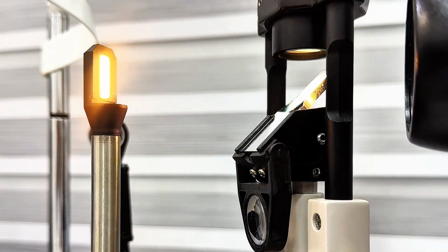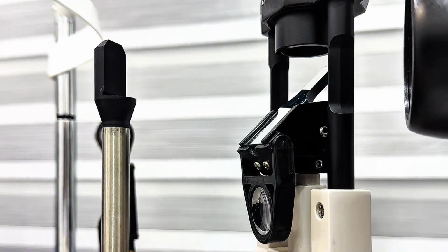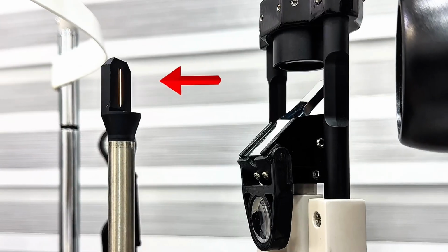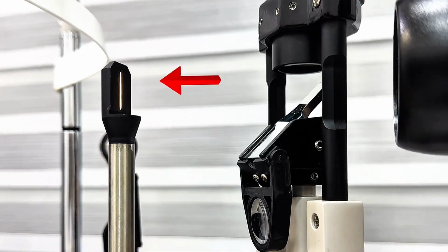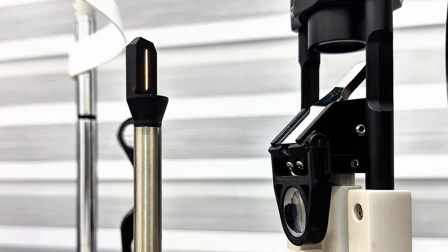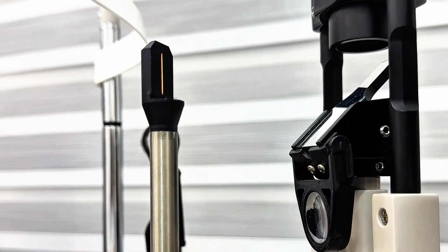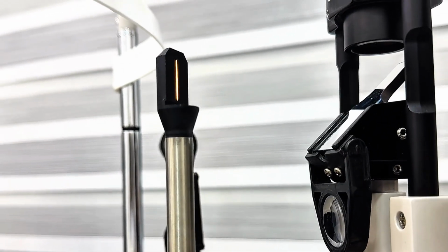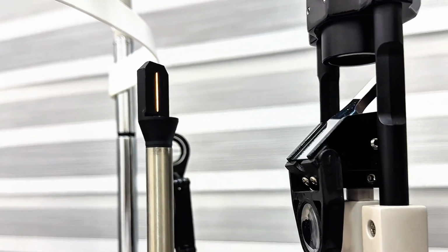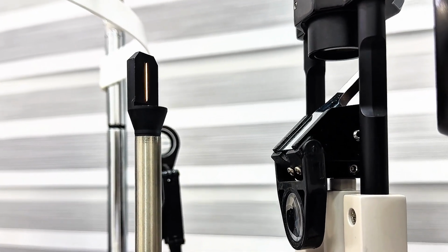Another way to do it is to turn off your slit width adjustment knob completely. When you turn it on, the first light that shows is the width you should use for your optic section or for your Von Herick technique. And once you get your slit width, this is now the time for you to increase your illumination brightness. Because the width is narrow, your patient is not going to feel dazzled by the light.